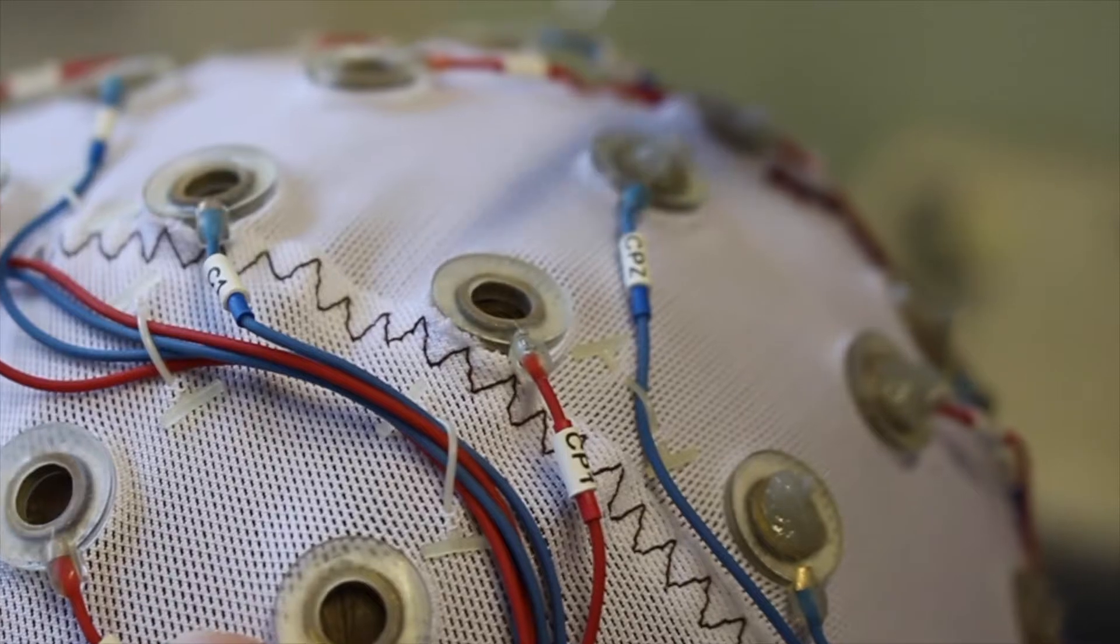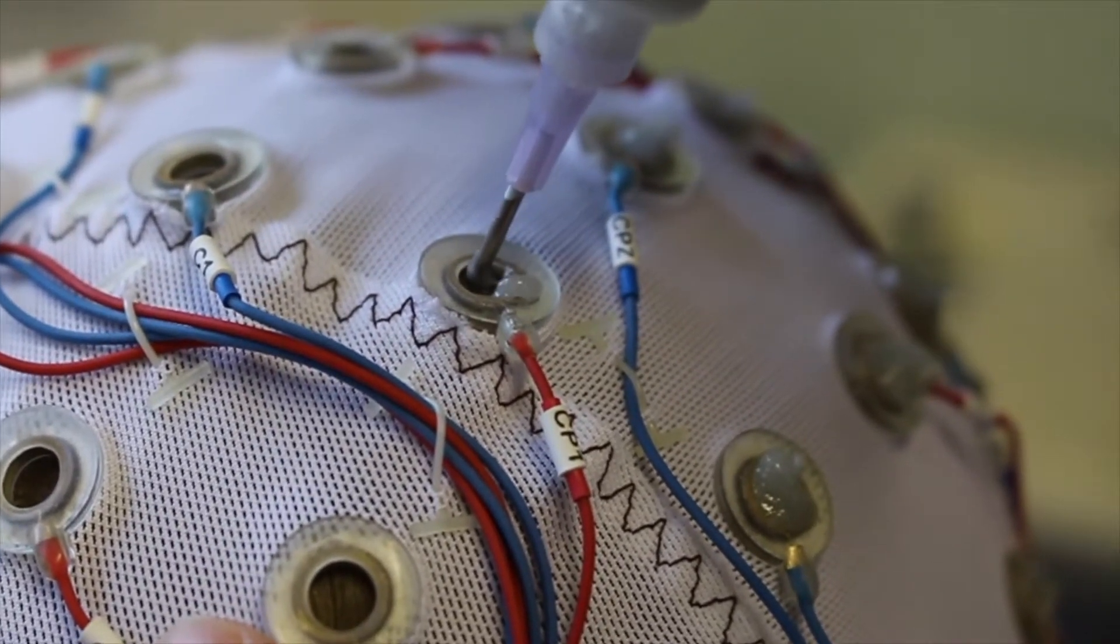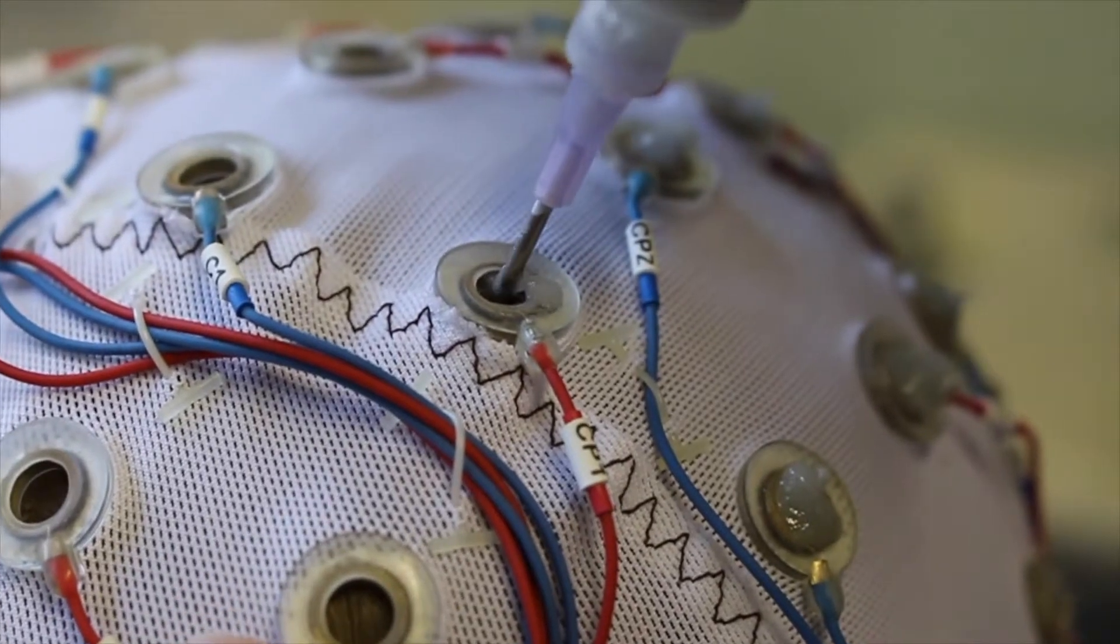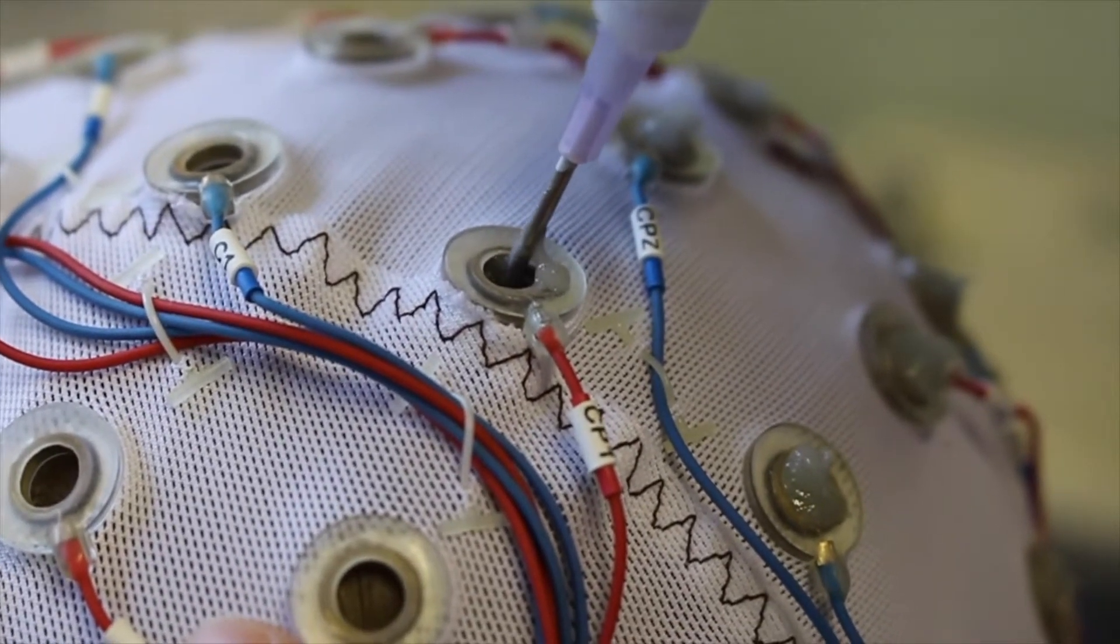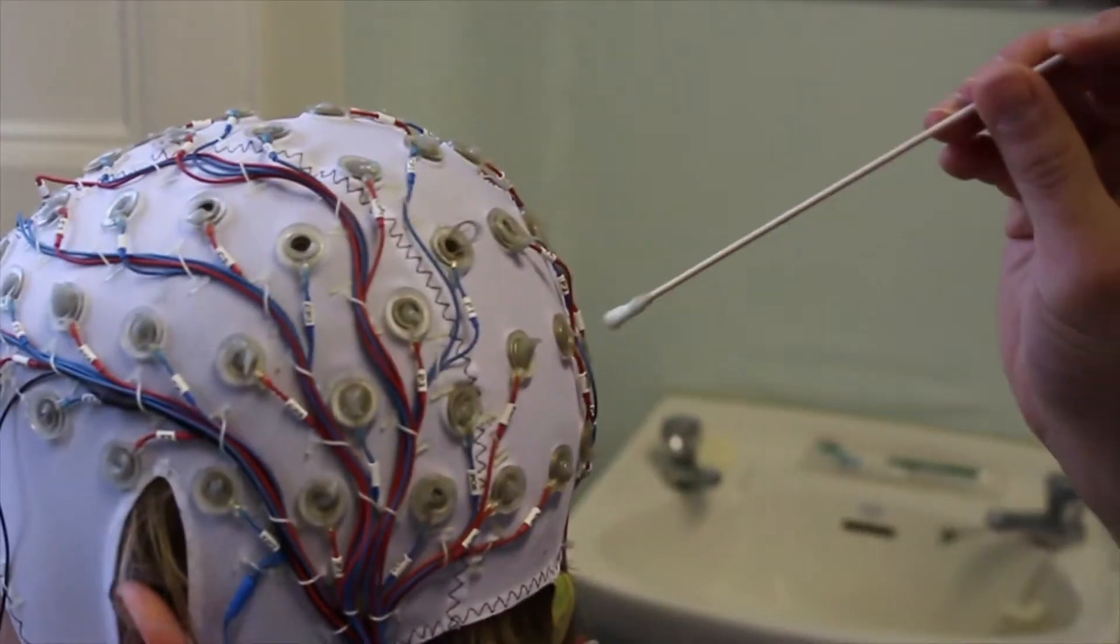There may also be a thinner type of syringe available to use, which can be useful if trying to part thick hair. However, if using this, be careful not to accidentally scratch the scalp. You will also need to replace the tip of the syringe every time you use it on a new participant.